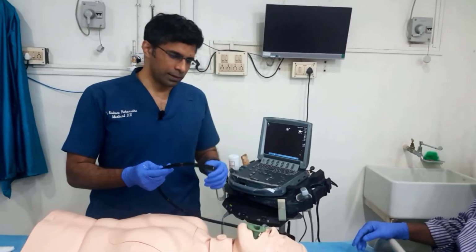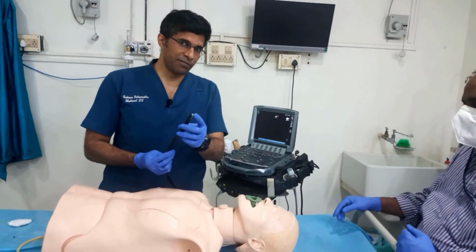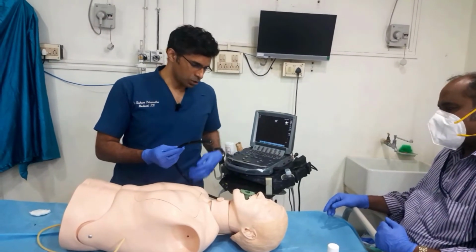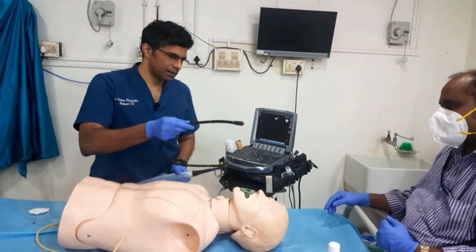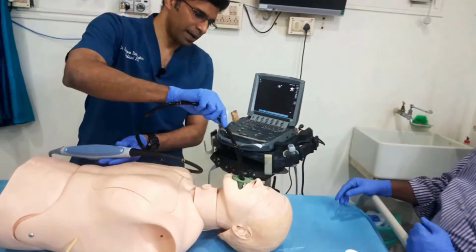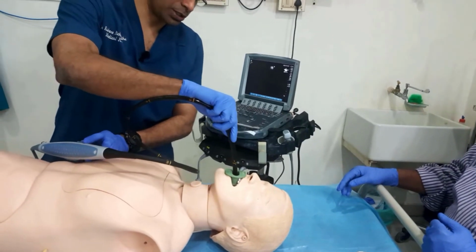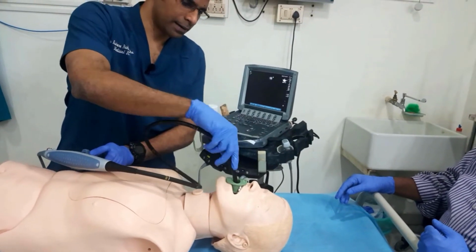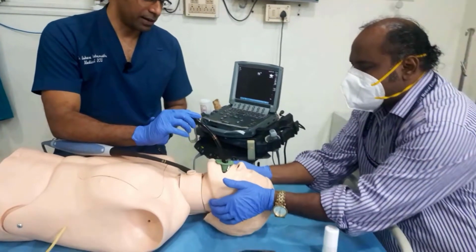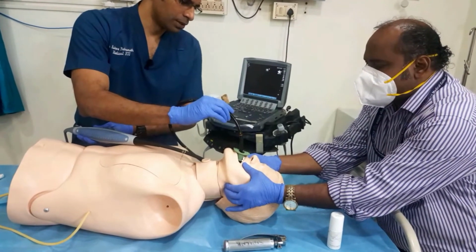To insert the transesophageal echo probe, we must remember to face the surface of the probe towards the floor of the mouth. Okay, so when I'm inserting it, I put it in this way, and after making sure that the probe is adequately lubricated, I just push down, and a little bit of jaw thrust often helps to make sure that it goes into the esophagus.